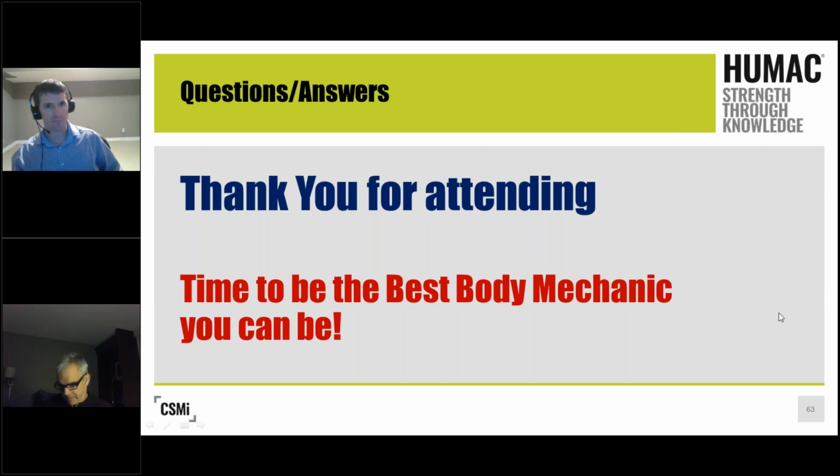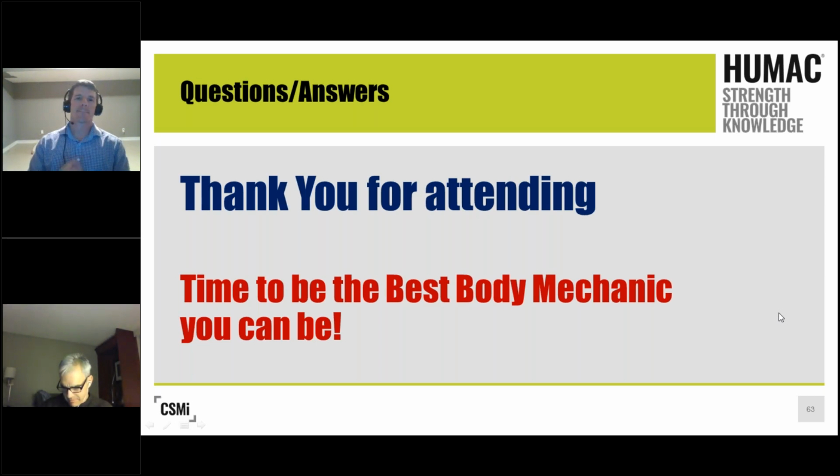He wants to know, at what time is it safe to begin eccentric strengthening after an ACL reconstruction? Well, that's interesting, because when we talk about eccentric strengthening, what are we actually really talking about? So early on, do we want to activate the muscle? What if I told you that if we put them in an eccentric unloading exercise, we could actually activate the muscles eccentrically under what a non-weighted isometric contraction would be. So it might be appropriate for us to do it fairly early in the rehabilitation program.